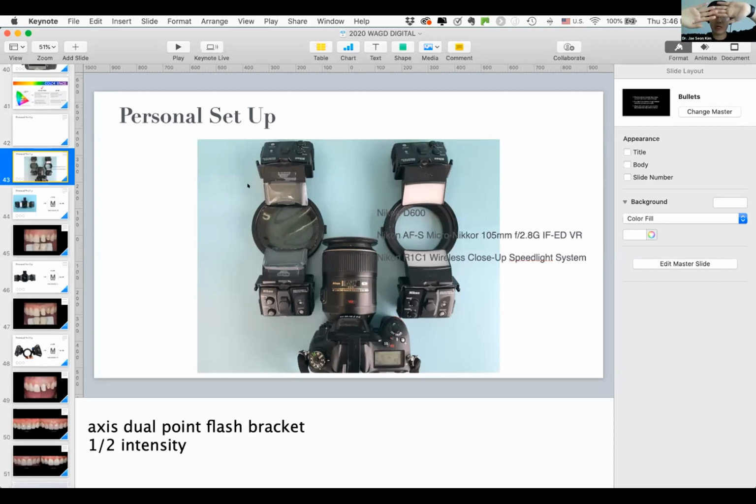If you take these polarizing filters on the flashes and move one of them to the other side so it's off 90 degrees, it won't have the same effect anymore. So you just have to see it once. Like I said, I have it on my YouTube channel. If you see how it's cut and how you put it in, you can even play with it too.